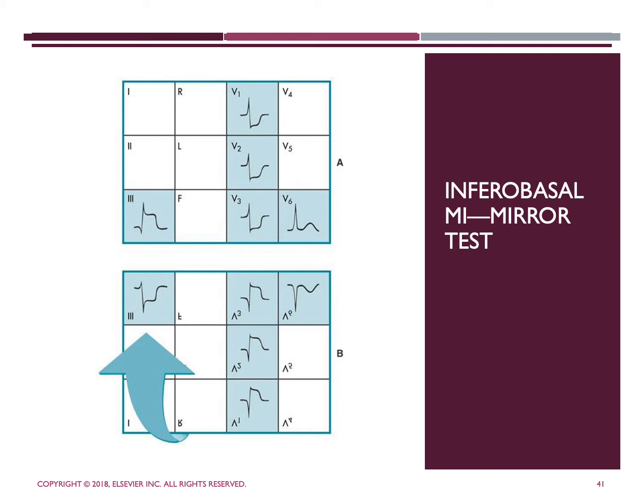What a positive mirror test suggests is that the lead changes observed in figure A may actually reflect associated acute inferobasal infarction.